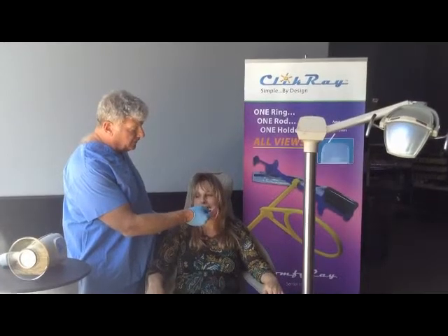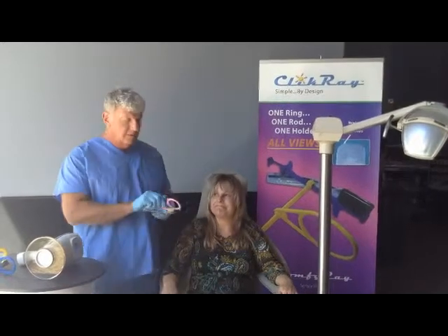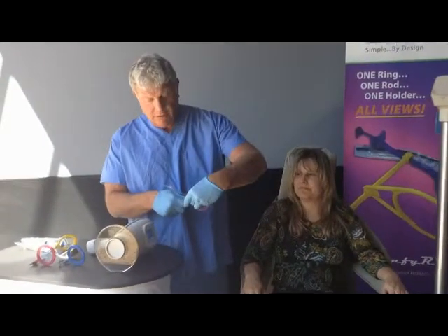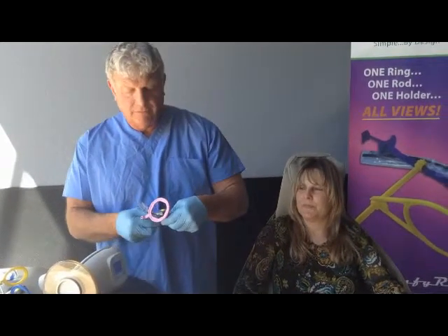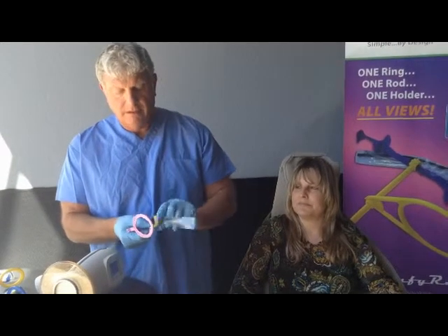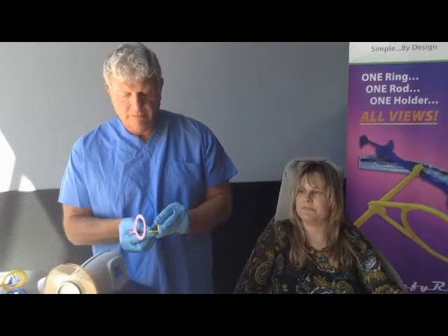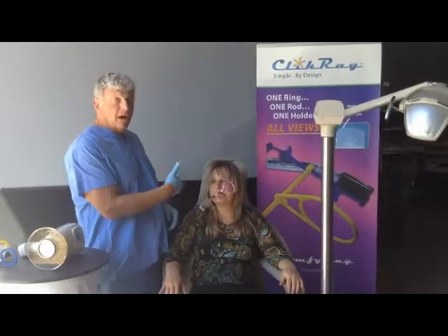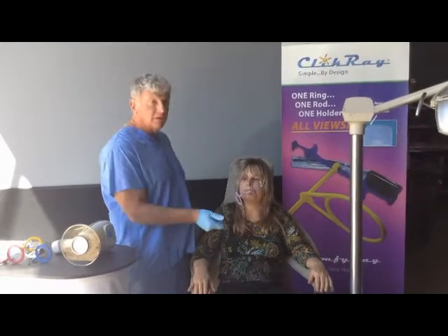We turn this over and place it in the mouth for the lower left hand side. When we take this out — this is our learning curve, just so you can see — all you have to do is take the ring and place the ring on the opposite side. We take our bite block off and reposition it. The sensor in this case would also have to be repositioned. And now we're ready to take our upper left and lower right radiographs.